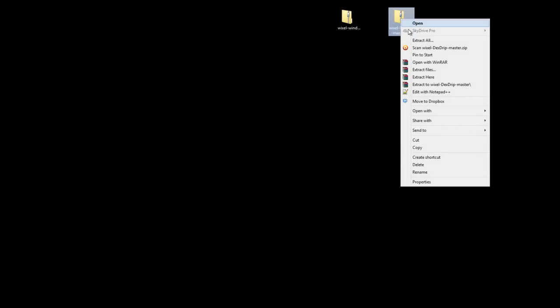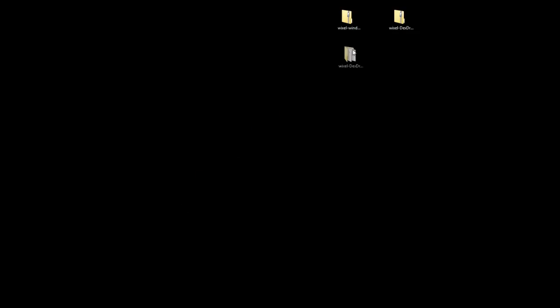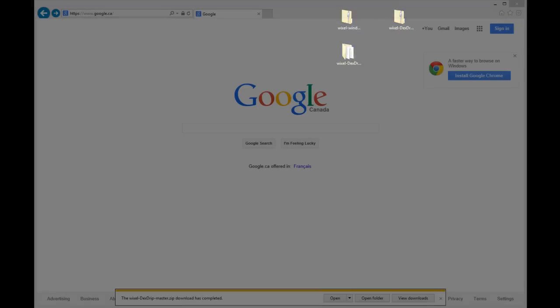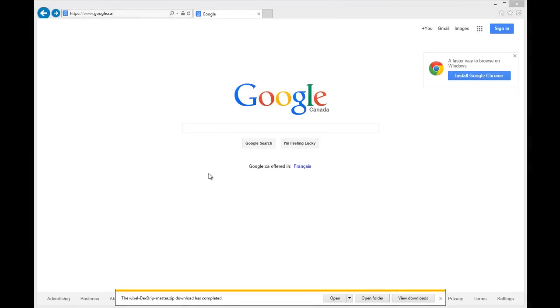Next thing we're going to do is extract that. I use WinRAR but you can use WinZip and extract that to your desktop, and then you can get rid of and delete the zip file.